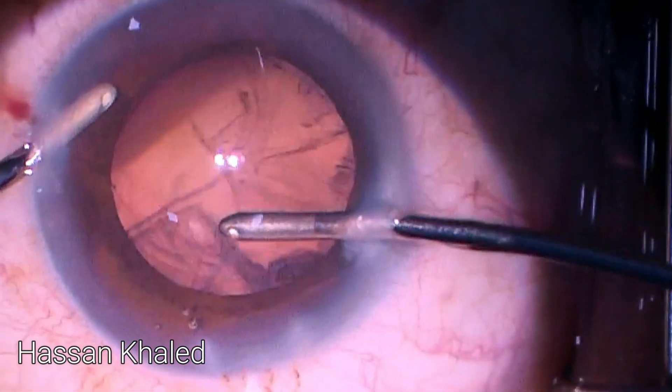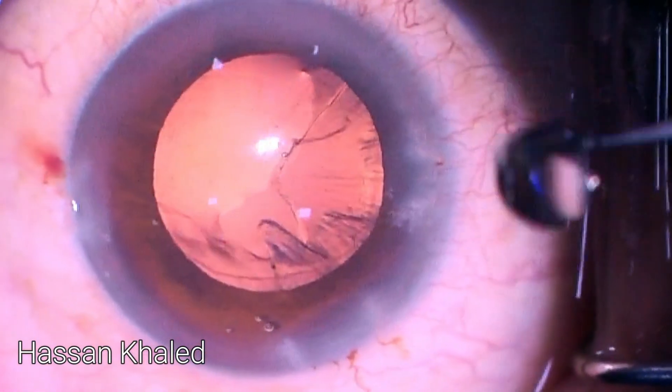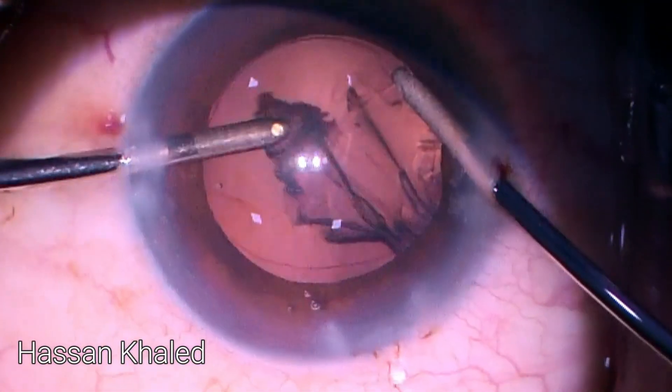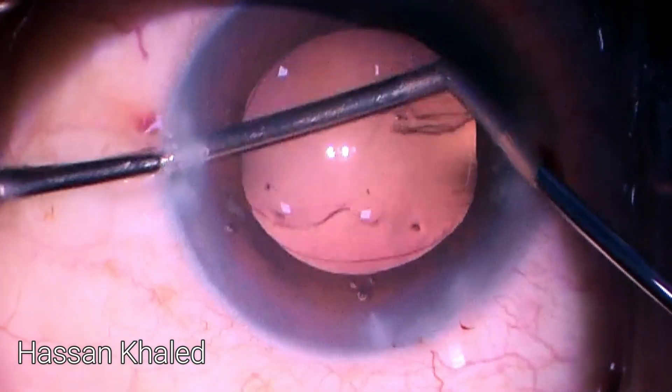Then I switch the irrigation-aspiration and complete the cortex removal. You can see here I'm twisting the paracentesis — this is my technique to prevent leakage: rotating around the irrigation probe to keep the anterior chamber and capsular bag well-formed.